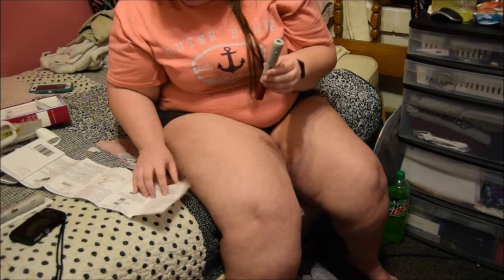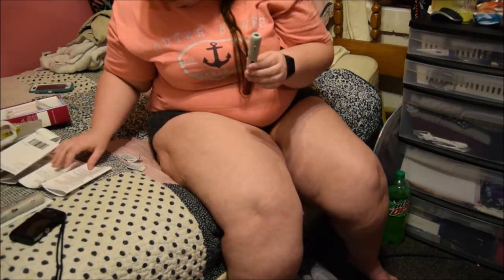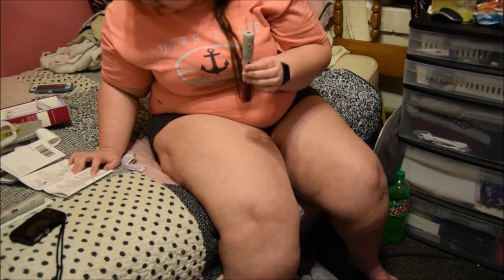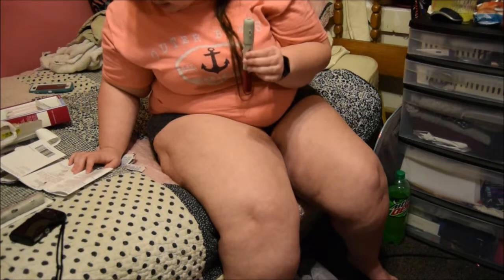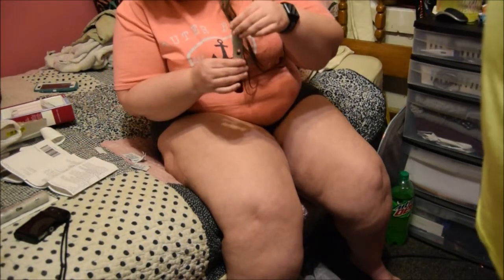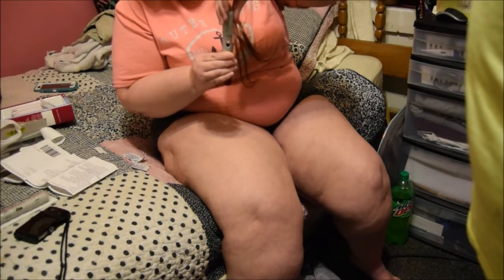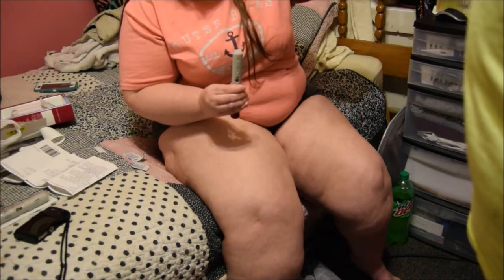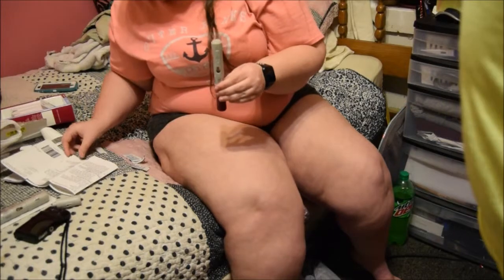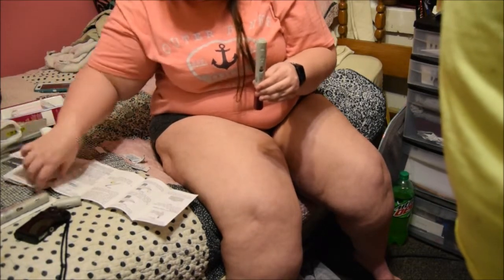I'm reading it over. It says, hold the middle of the pen so that you're not touching the gray cap. Turn the pen up so the gray cap is pointing up. With your other hand, pull the gray cap off straight up, do not twist. Don't twist it. Yeah. So I'll do that. Throw away gray cap. Okay. And then hold pen.